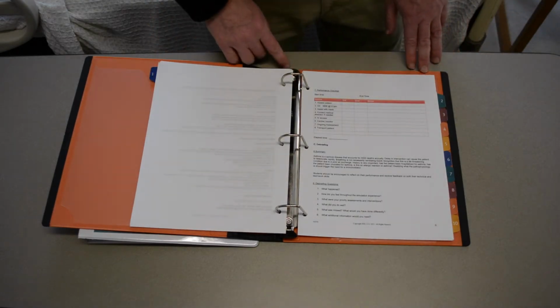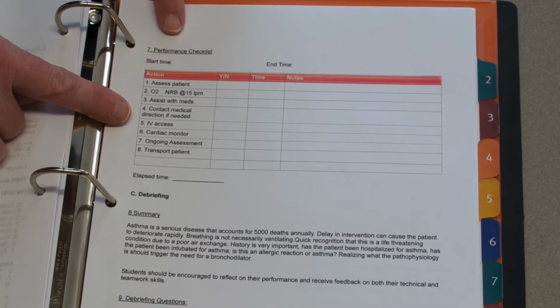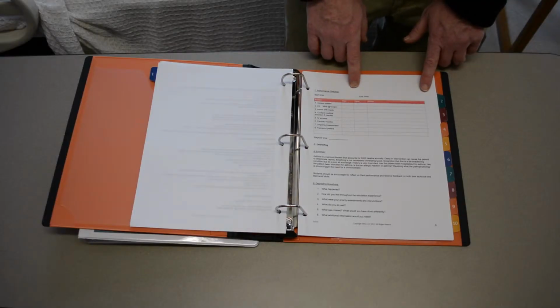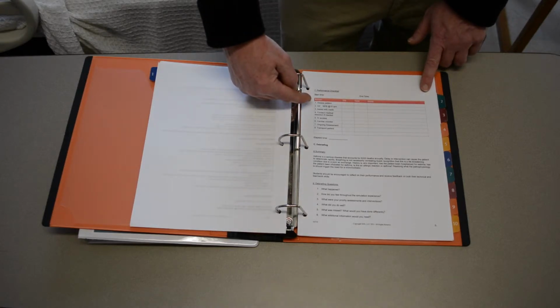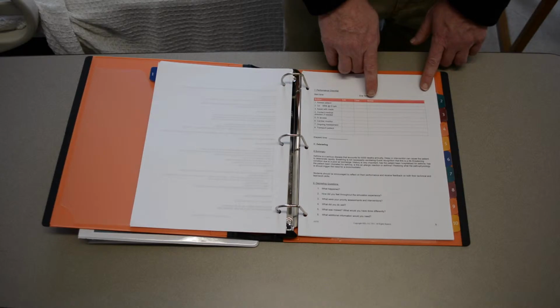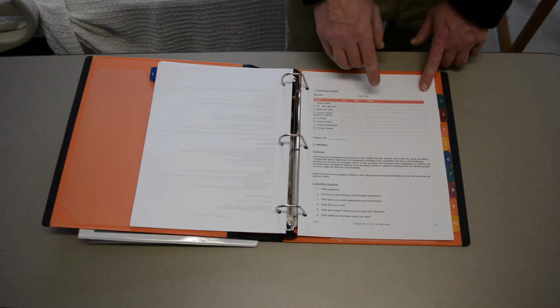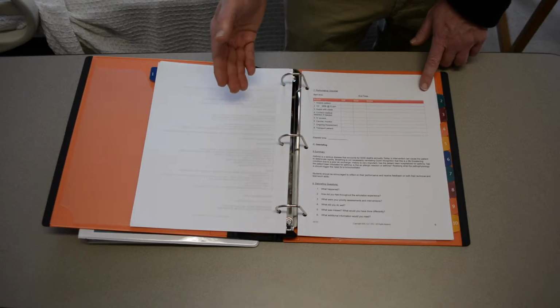The third part of the system is the post-performance or debriefing section, and in here we have a performance checklist which can be completed after the scenario or while it's run, listing once again the expected actions of an expert clinician, were they performed, yes or no, at what time they were performed, and any notes that the observer wants to record regarding performance of a specific technique, such as technique was well performed, not performed, dosage incorrect, etc.